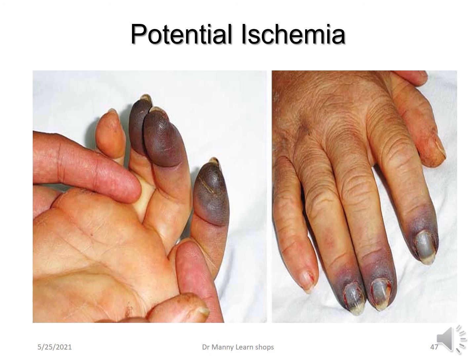Remember, the radial artery is the one that's being cannulated, and it supplies the hand, and it's got a backup in the ulnar artery, which is why you do the Allen's test, to make sure that the ulnar artery is patent before the radial artery is cannulated. If you're cannulating the brachial artery, there's no backup supply. If you occlude the brachial artery, that's potentially a problem. If you occlude the femoral artery, that's potentially a problem. If you go to the dorsalis pedis, well, you've got the tibial, which can provide backup. So potential ischemia is always something that you would observe for as a nursing consideration.